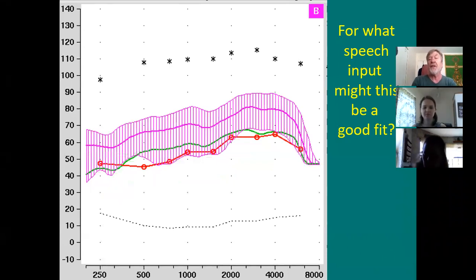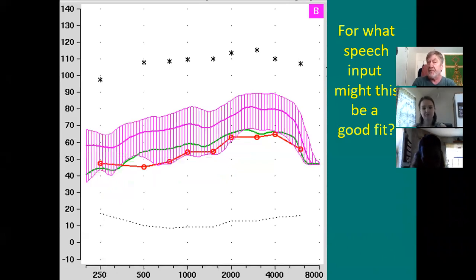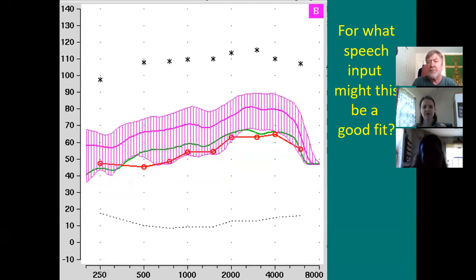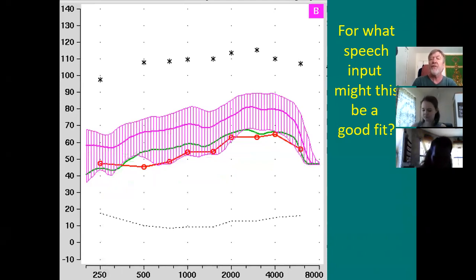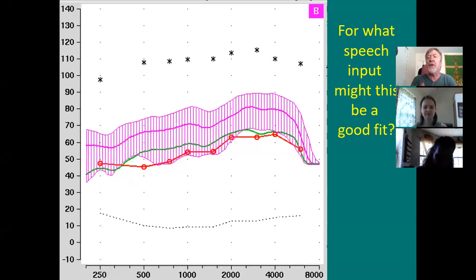For what speech input might this be a good fit? You've got the mean saved for soft inputs — this is the output you wanted for soft input speech. Now you did a second run. The mean for soft input speech is left here. How far is the mean above the thresholds? For average — it's less than half; you're around a third. And that might be a decent fitting for average speech inputs. This is basically what all hearing aid fitting formulas are doing — whether DSL-5, NAL-1, or NAL-2. They're all slightly different, but basically doing a similar thing.